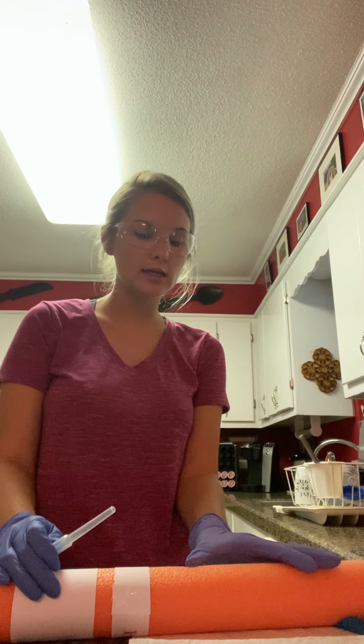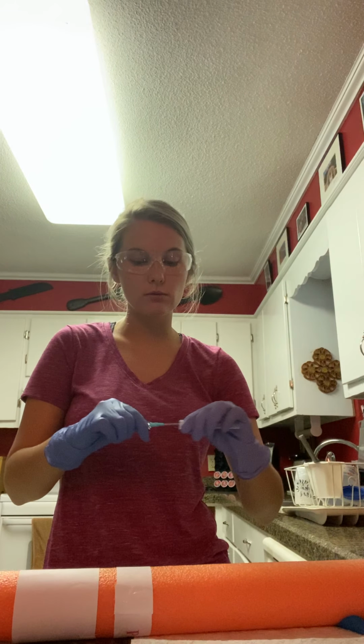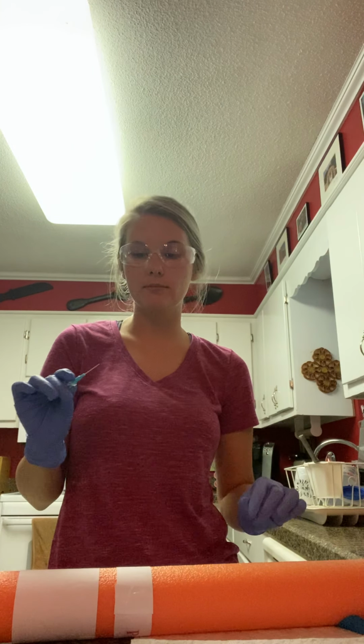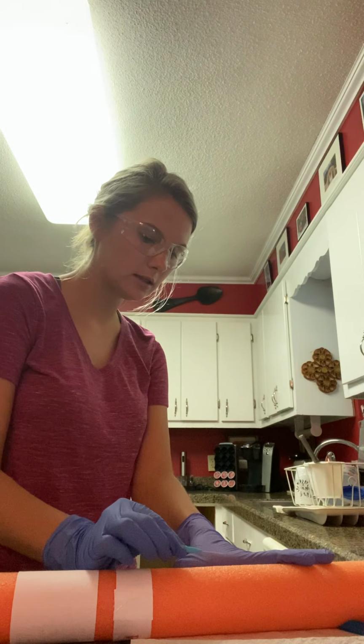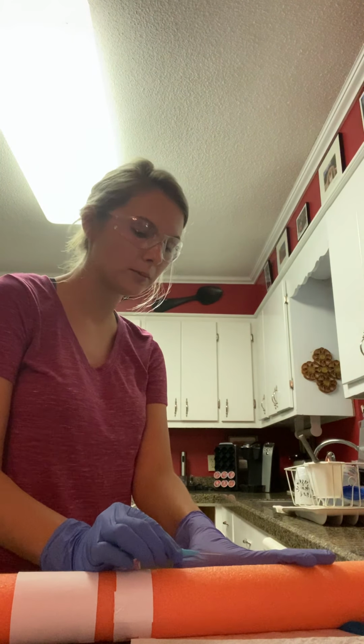Next, I will perform the puncture. I would ask the patient to remain still. I would instruct the patient that there would be a quick stick, and I would insert the needle at a 10 to 30 degree angle. I will anchor the skin about 1.5 to 2 inches below the insertion site, still not touching the area I just cleansed. I would make sure I do not touch the catheter to my glove. So I will anchor 1/2 to 2 inches below and insert at a 10 to 30 degree angle.